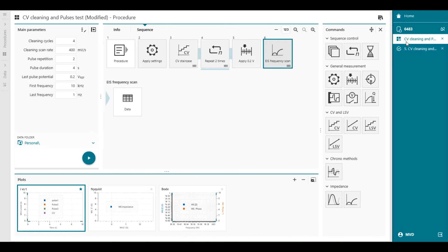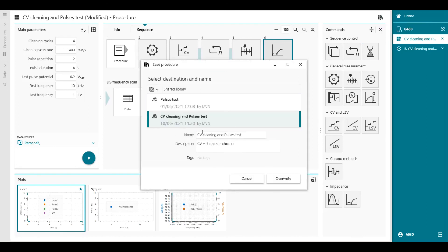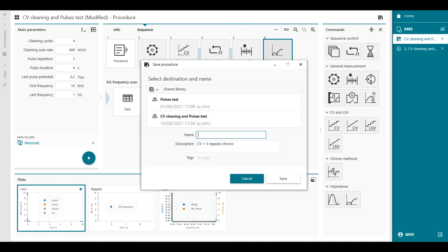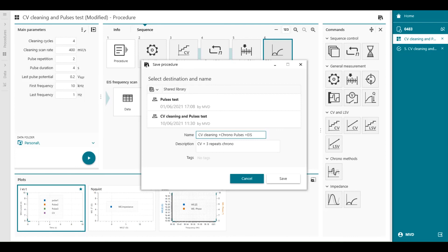So my measurement of my procedure is finished. I can save it. And now we have added another thing to it. CV cleaning plus chrono pulses plus EIS. I can save it.